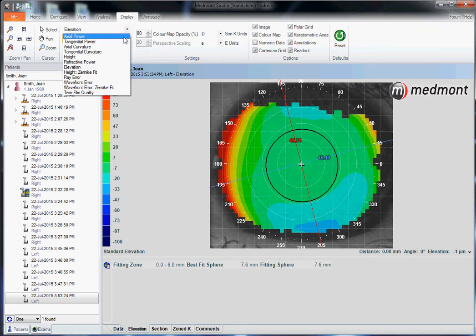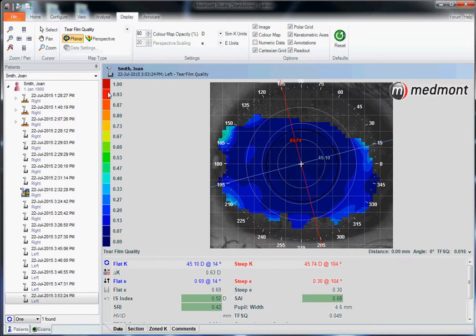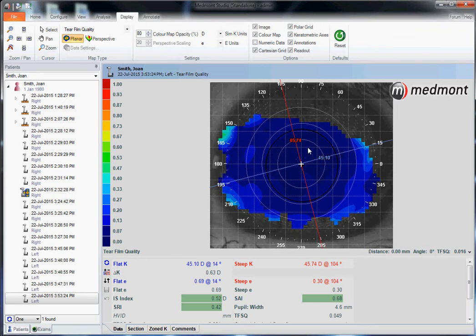We can also interpret this topography based on tear film quality. The dark blue color covering the vast majority of this image indicates that the tear film on top of the cornea was very smooth. Dark blue indicates smooth placido reflection. If we saw hot colors, that would be indicative of tear film breakup or dry eye.